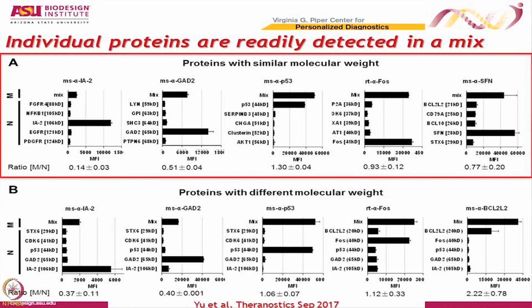And then on the same slide, we separately printed each of those genes individually. Then we probed that array with an antibody that recognized one of the proteins in the 5 and asked, even though it was expressed in the mixture, did we detect it? And did we detect it as well in the mixture as we did individually?